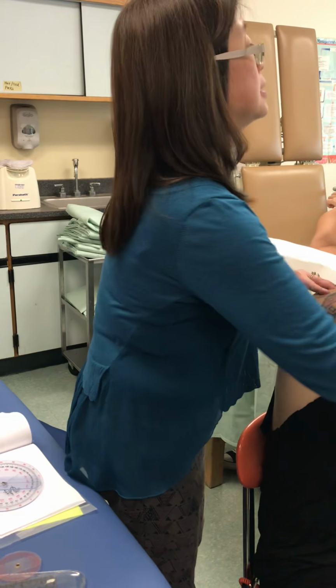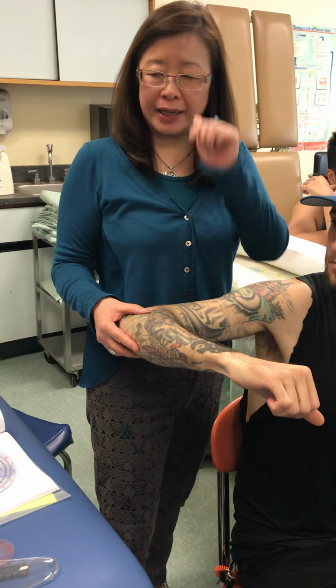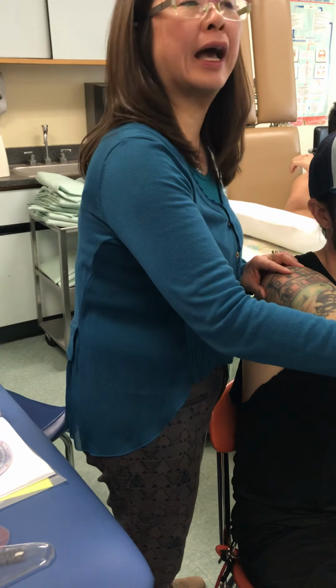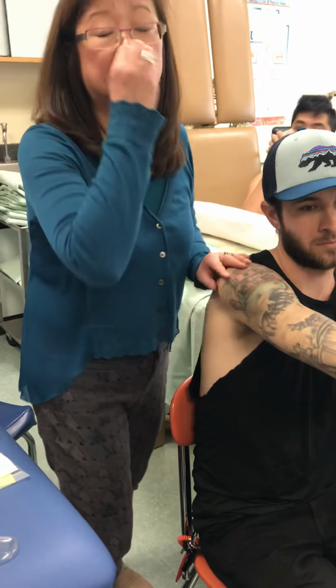Since we're going by whatever the book says, it says horizontal abduction and adduction starts at 90 degrees of flexion. That's why we have more horizontal abduction, because we're just going by the definition in the book.